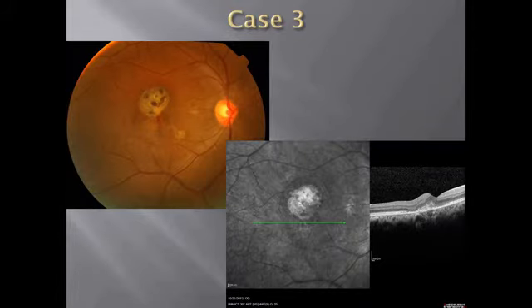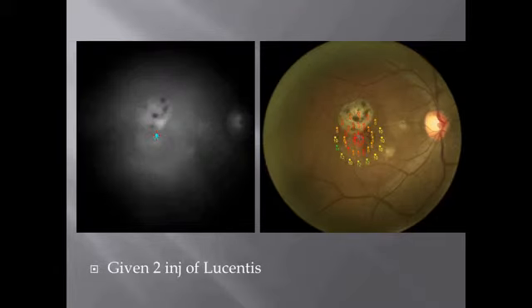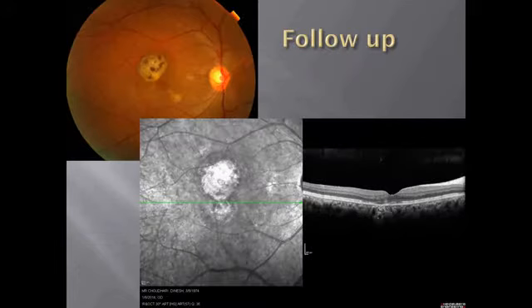This is a patient with a CNVM. You see a scar, and just below the scar you see a reddish hue. So there is a formation of a CNVM starting from the edge of a scar. The OCT tells you exactly where that's happening in relation to the scar, and we do the microperimetry, and you can actually see that the scarred area, of course, is red, but even the area just below where the recurrence is documented quite well, and the reddish hue which is showing up there, and that's where the fluid is accumulating.